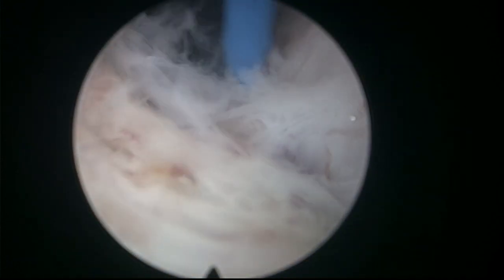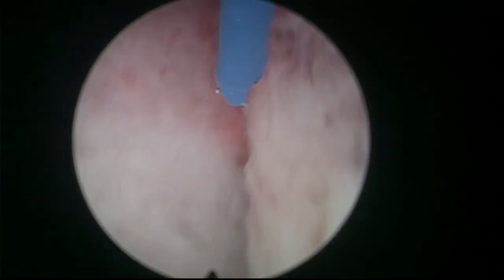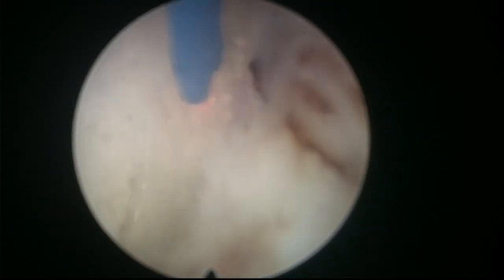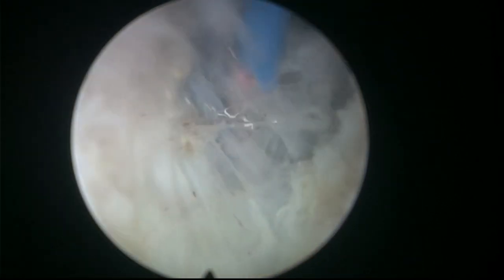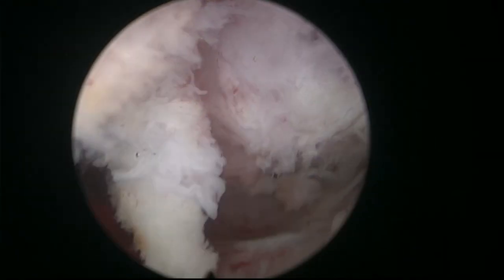Now when we use Moses, I think we could shorten that. We are planning to do a study of a day case holmium enucleation in patients with BPH, because the hemostasis we achieve with Moses is slightly more reliable, and patients do not need postoperative irrigation. And probably we can take the catheter out, they can go home. So we have this situation where we operate mainly in the afternoons, so we would have to change our schedule to operate in the morning to be able to discharge the patients later on during the day. It's been done in America, and there are more and more centers publishing their day case HoLEP experience. So I think it's a big, big, big step forward provided by Moses.